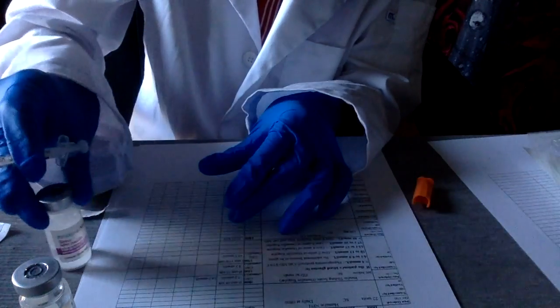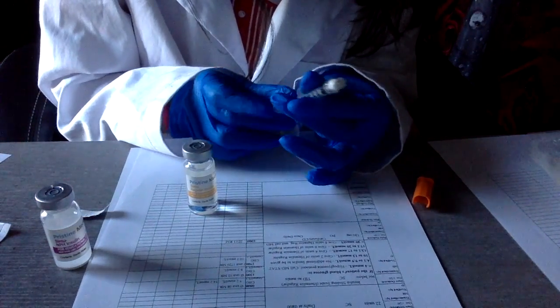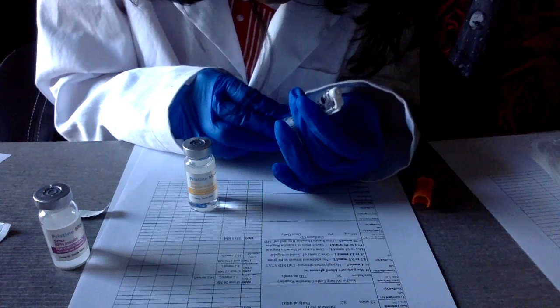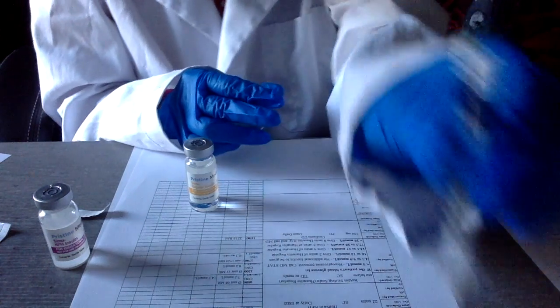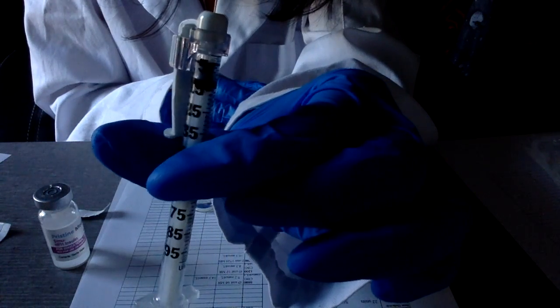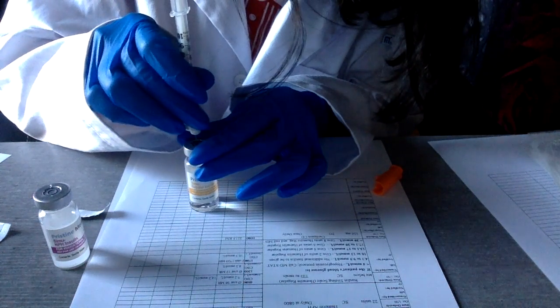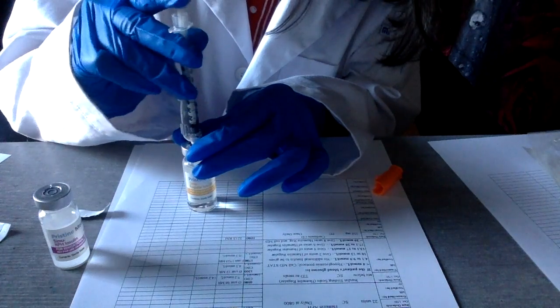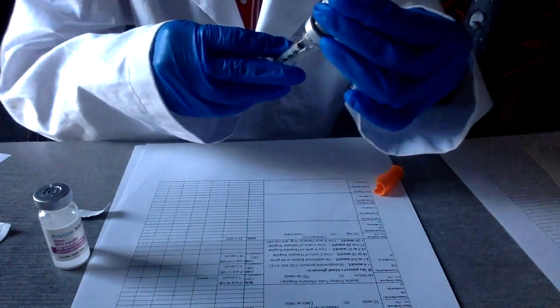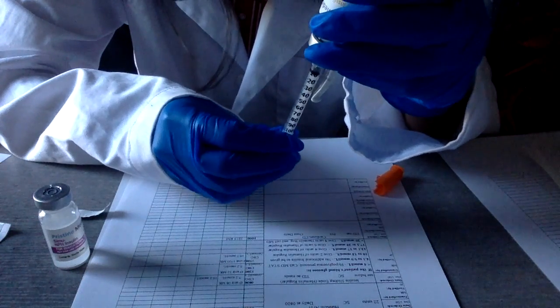Alright, you remove it, take the Humulin R, get 4 units of air, 4 units. Inject that into this vial, Humulin R. And instead of removing it, you just invert the vial, and we draw out 4 units.